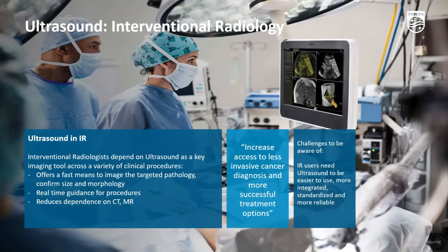Fusion and navigation play an important role in interventional radiology. Percutaneous treatment of liver tumors using microwave or radiofrequency ablation requires precise needle placement for effective therapy.